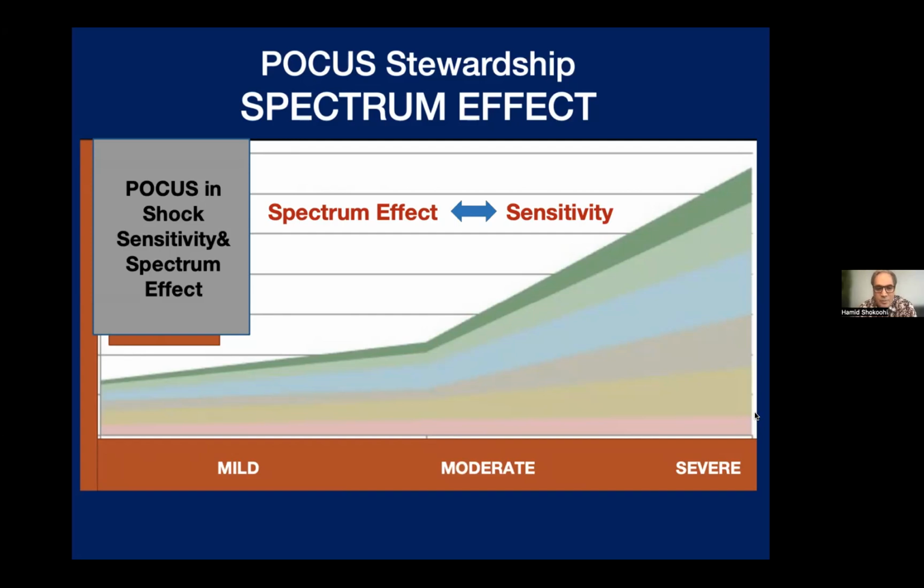You just see that pericardial effusion that caused tamponade, then done. But if the patient has a little bit of trace effusion and you find it with ultrasound, and it's not even affecting the blood pressure or anything related to that, who cares? You know what I mean? So that's very important to know. A lot of those cases are sick for a long time, which means severity went up. The patient has had diarrhea for 4 days. The patient has had cardiogenic shock for 2 days. In those, ultrasound is much more important and impactful than in the overall population that you show.